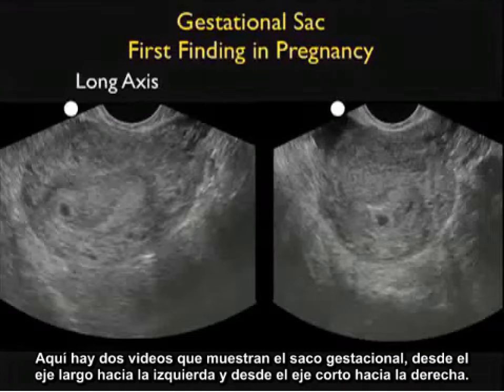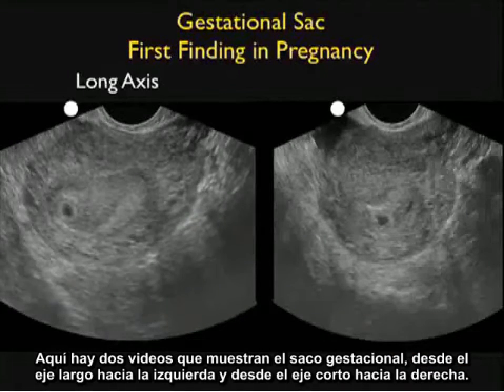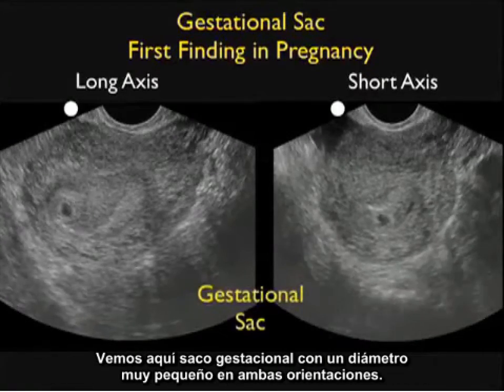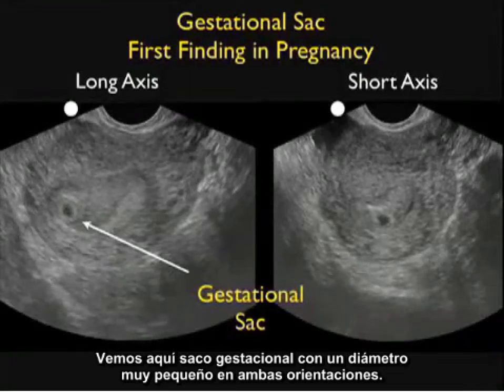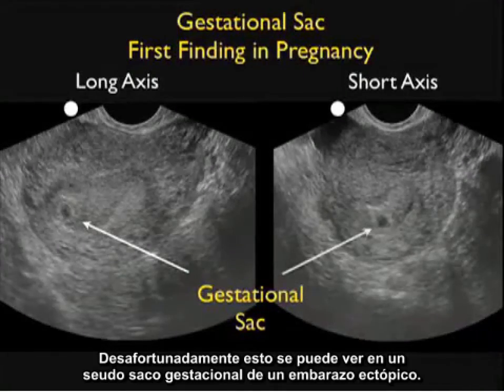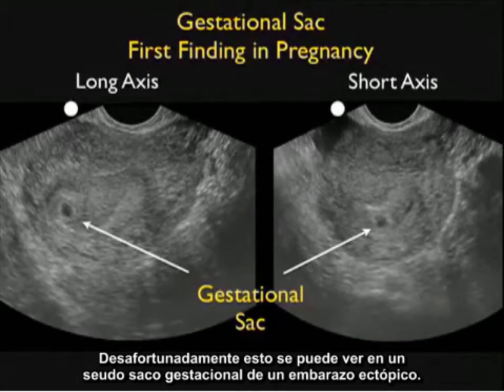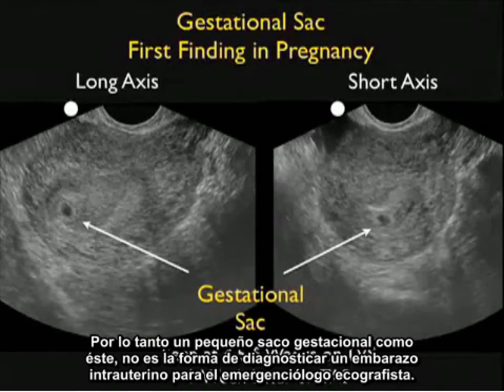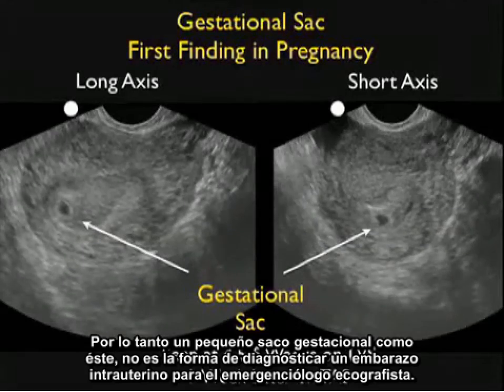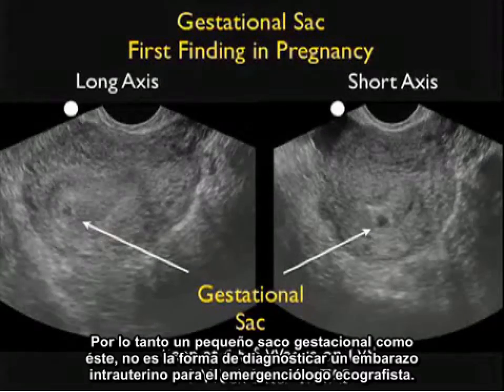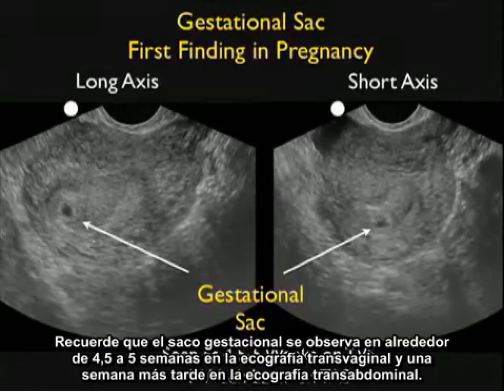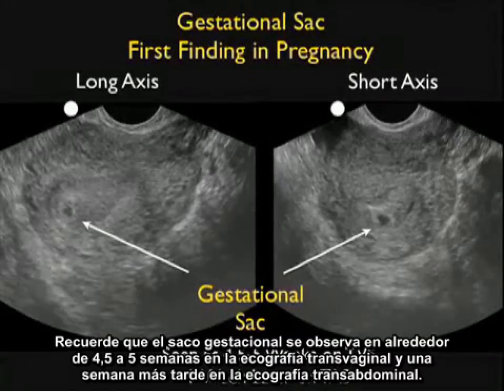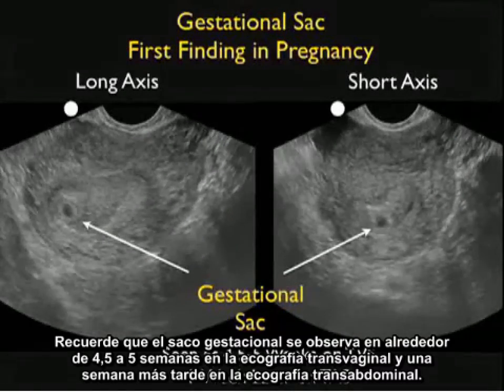Here are two video clips showing the gestational sac — long axis to the left and short axis to the right. We see a very small diameter gestational sac in both orientations. A small gestational sac like this can be seen with a pseudo-gestational sac of ectopic pregnancy and is in no way diagnostic of an intrauterine pregnancy for the emergency physician sonographer. Remember, the gestational sac is seen at about 4.5 to 5 weeks on transvaginal sonography and about a week later on transabdominal sonography.